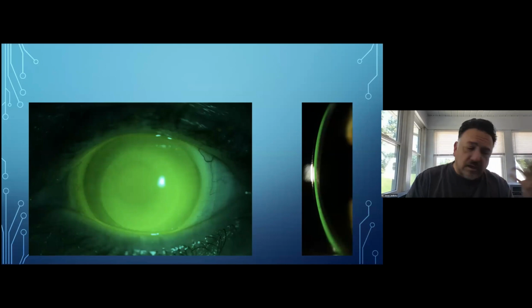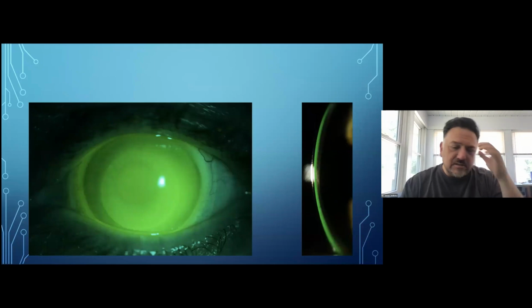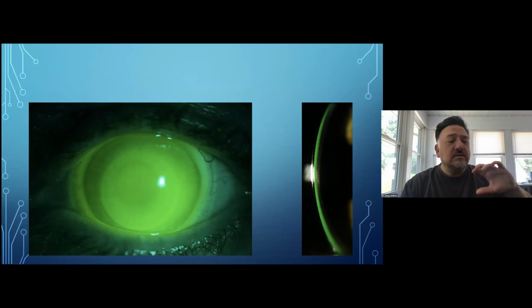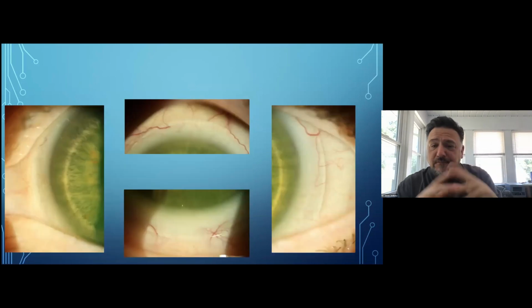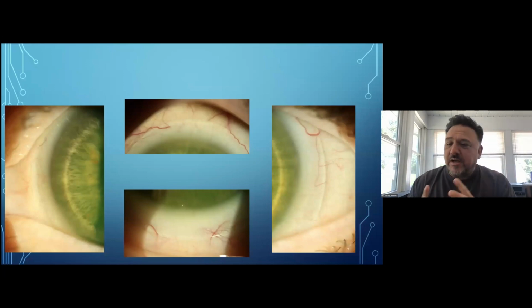And of course, like anything that's map based, right? It's only going to be as good as the map that you're giving it to work with. So do make sure that if you're doing an instrument design lens, that you put the time in to ensure that that map that you're feeding into the software is as good as it can be. It's as reliable and predictable.